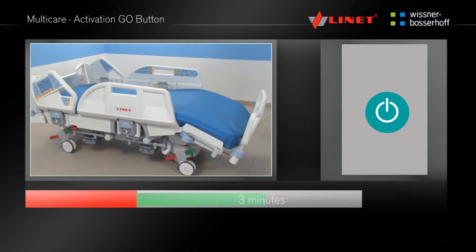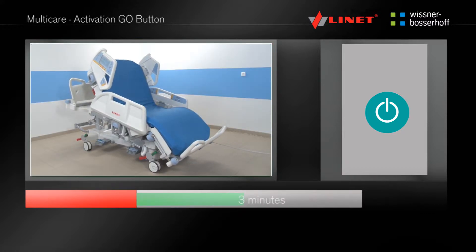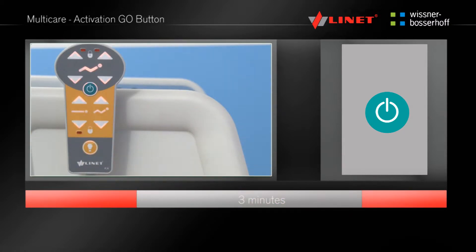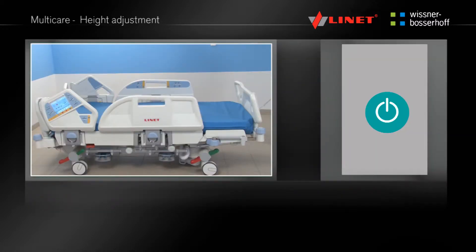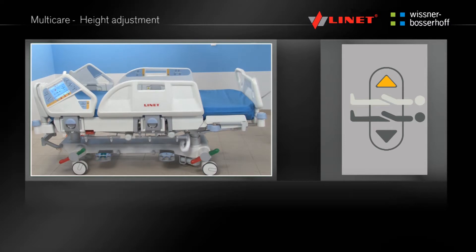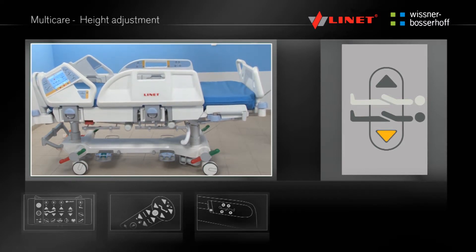If the function button has not been pressed for three minutes, the functions are locked and the Go button must be pressed again to allow positioning. Activate the function by pressing the Go button. Press and hold the function button until the desired position is reached. This function — height adjustment — is located on the Supervisor panel, handset, integrated side rail controls, foot controls and the MobiLift.